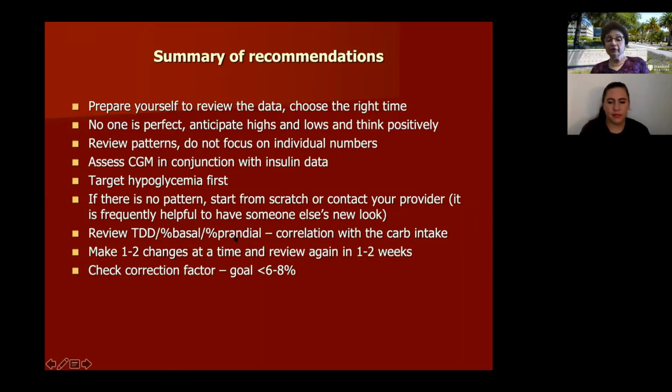So again, if you're a carb eater and your percent of prandial is low, then clearly carbs are underestimated. Make 1 to 2 changes at a time and review the data in 1 to 2 weeks. Have someone count the carbs with you. It's actually a lot of fun.